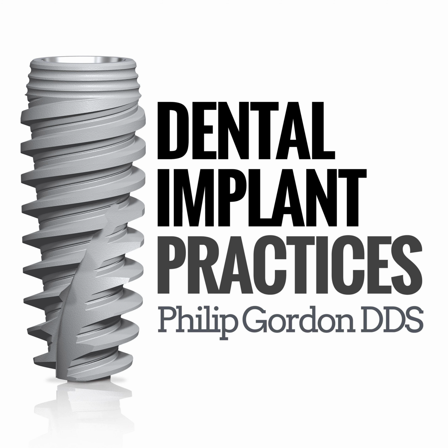So I do everything guided implant surgery. I don't freehand place implants. And I hear people say, well, guided implant surgery is for people that don't know what they're doing or they're new at placing implants. And my argument to them is that guided implant surgery raises the bar for all of us. It improves the efficiency, the accuracy of implant planning and implant placement, no matter what level you're at. And as you become more advanced in implantology, what guided implant surgery technology allows you to do is to plan bigger cases and to be able to execute them more accurately and more efficiently.